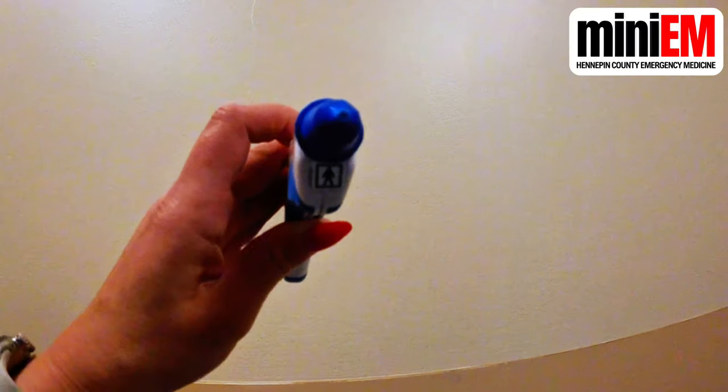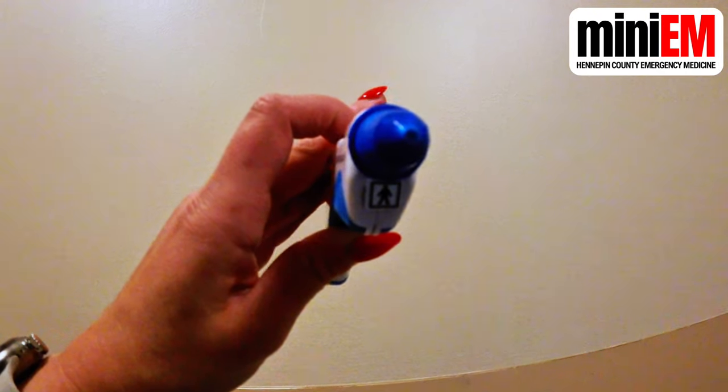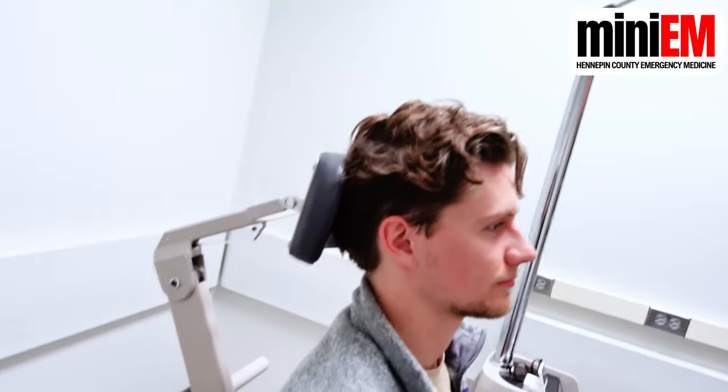Next, set your patient up so that there's something behind their head. It's pretty natural to lean away when someone's coming at your eye with something, so you need them to have a head rest, which can be a backstop.